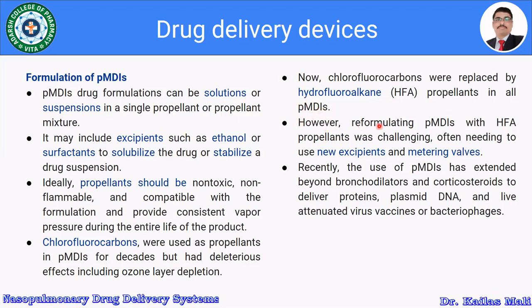However, reformulating the pressurized metered dose inhalers with HFA propellant was challenging, because we have to think about solubility and other formulation aspects, often needing to use certain new excipients and metering valves. That means we have to think about the design of the pMDIs.